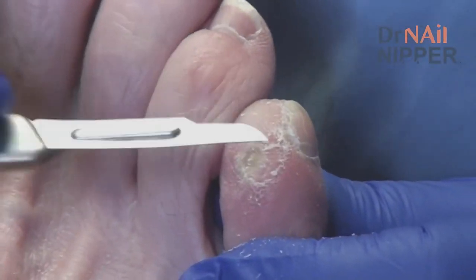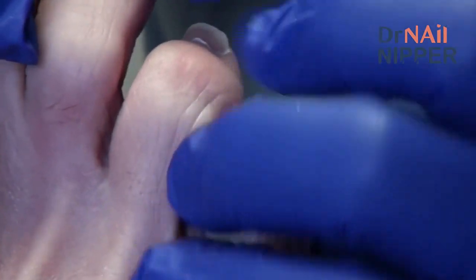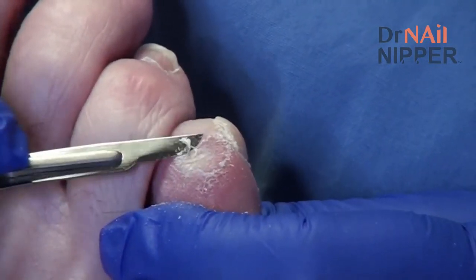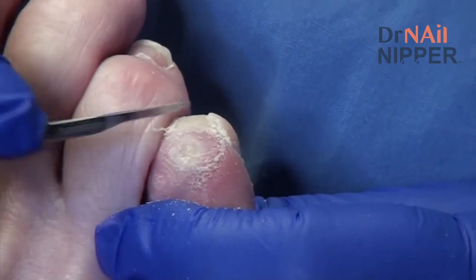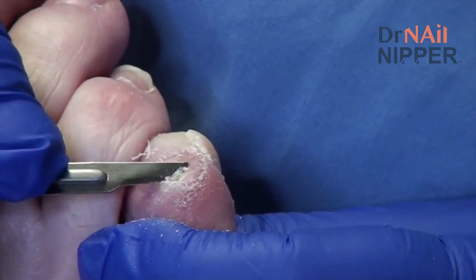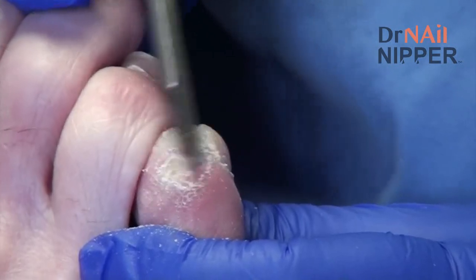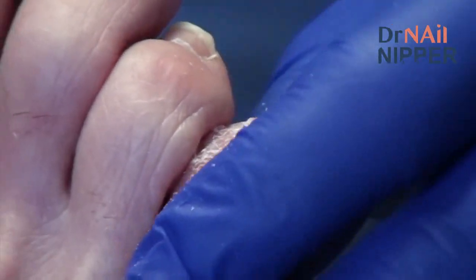There are a few different kinds of pads that I can show you. To me that just looks like there should be an open sore there, that I'm just not deep enough to see it. I'm not creating one — if there's not one, I'm not going to create one there. But just given how painful this toe has been, you said you can't even wear shoes on this foot, right? It isn't a constant pain — you said you can go hours without any pain at all. Well let's see if just by trimming off all the thick skin over the top of that, if that maybe helps.